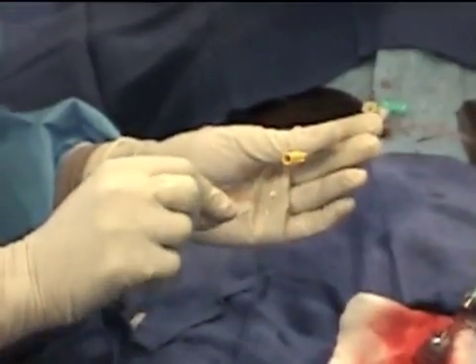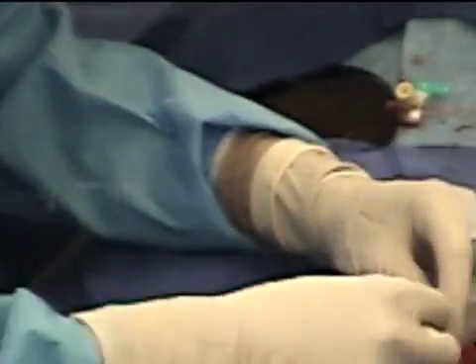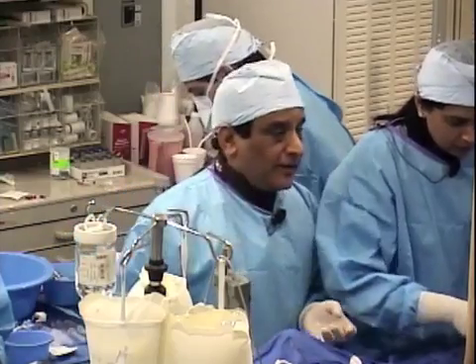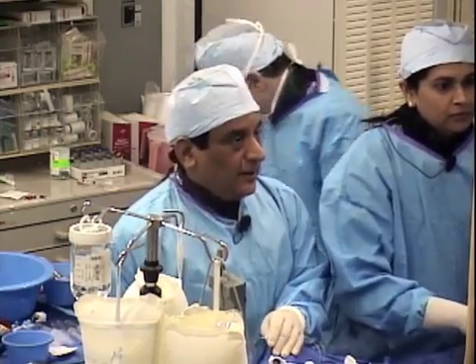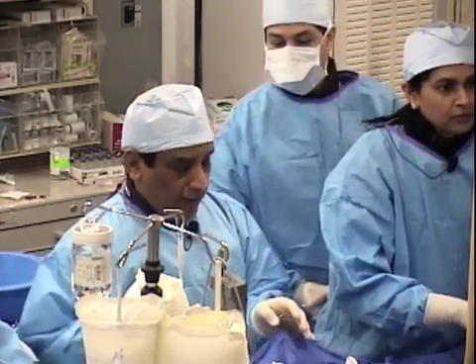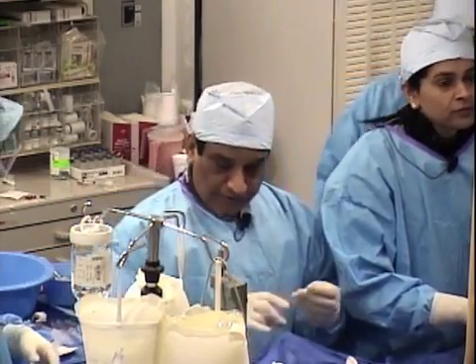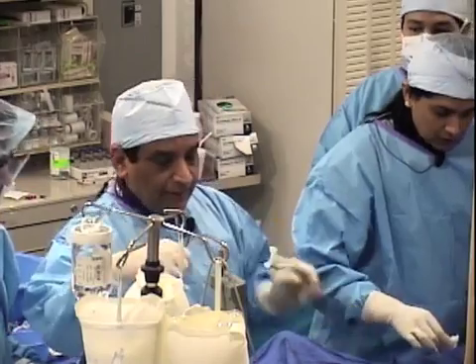So, a question. But you are right. I think the Boston Scientific folks should put in a little money. I know that all has been in DES technology, but if you can just change the wire and of course the burr to accommodate the 0.014, it will make our life so easy. Well, with the expanded viewers we are having today, I am sure a lot of folks are listening, and hopefully some engineers will get behind this task. Yep. And make it a monorail.